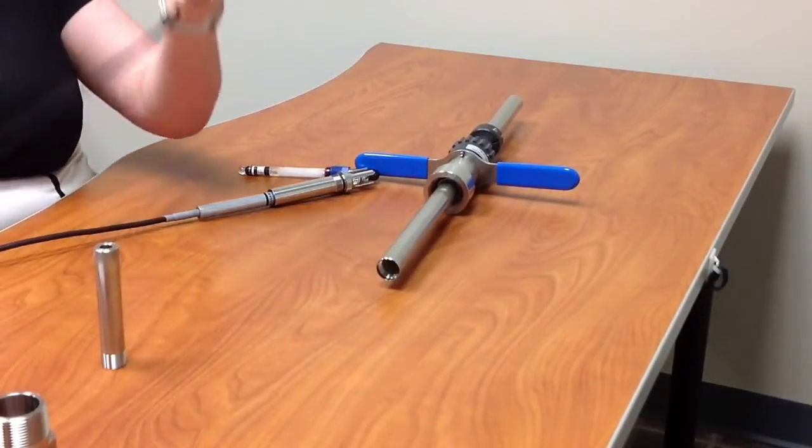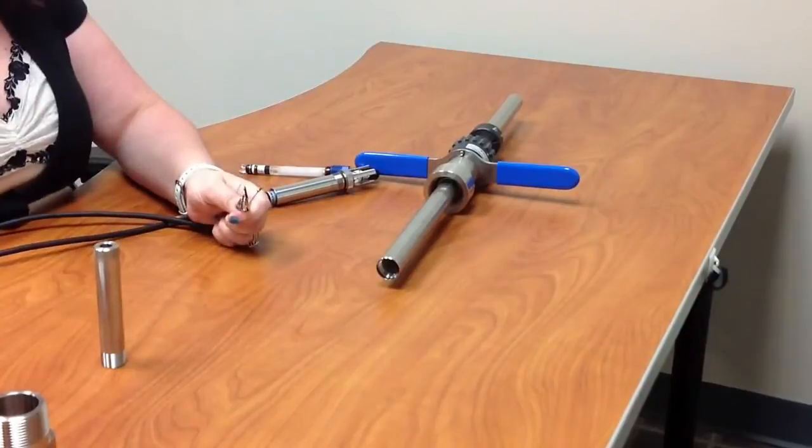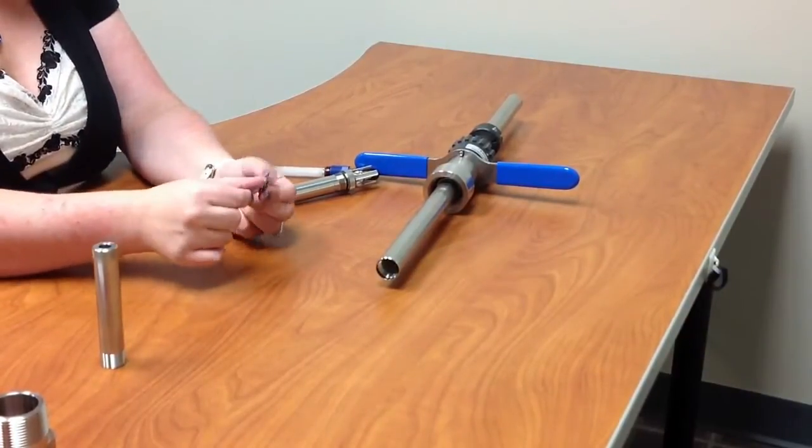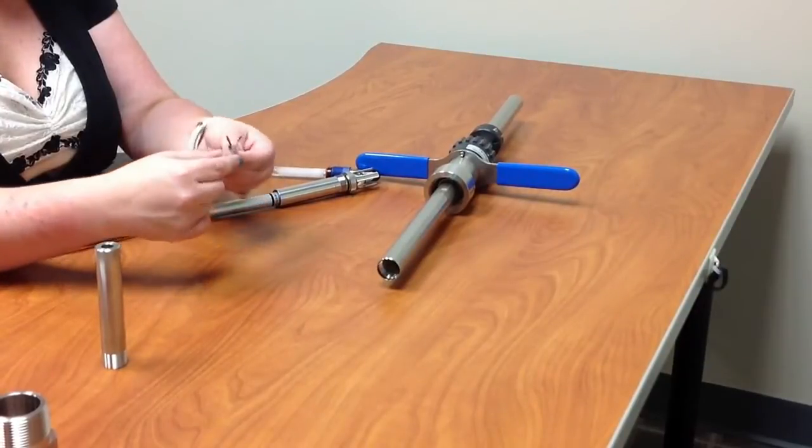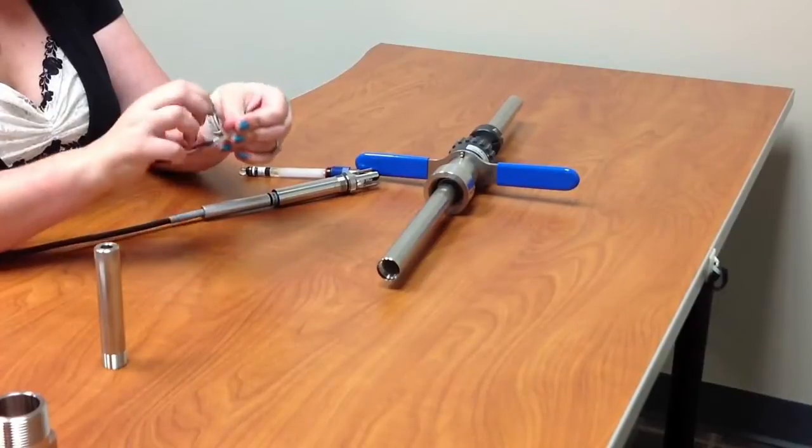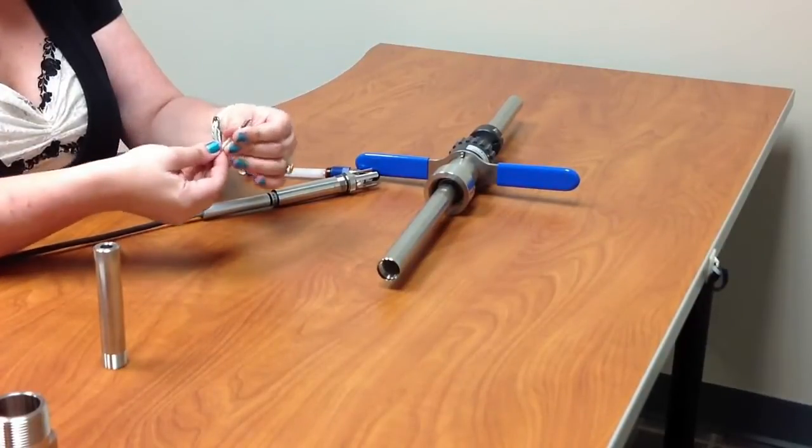You're going to need to take your leads, and just for ease, I have some Scotch tape that I'm using. You just want to tape the leads together to make it one solid lead. It makes it easier for installation.